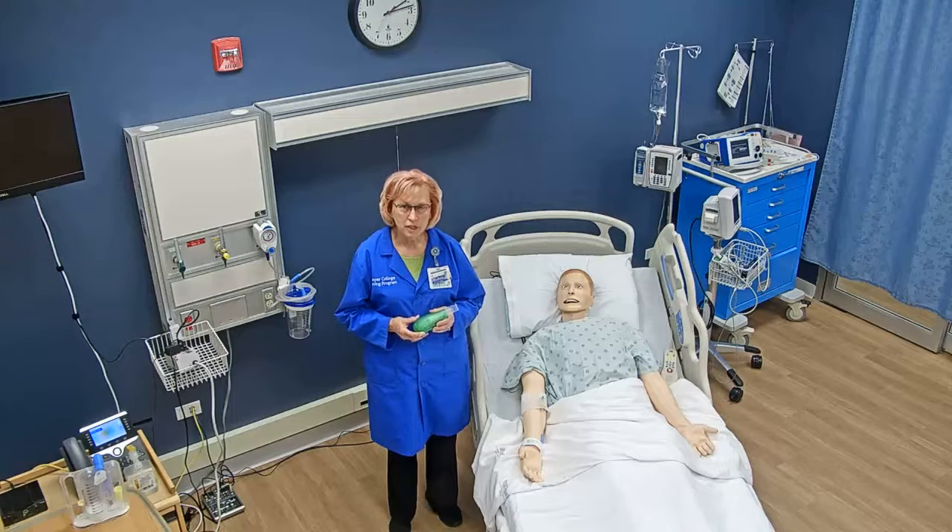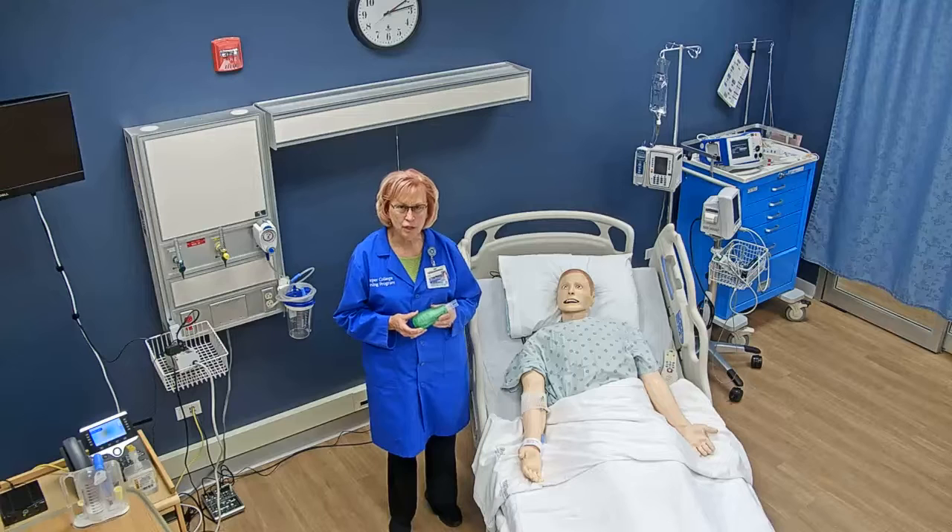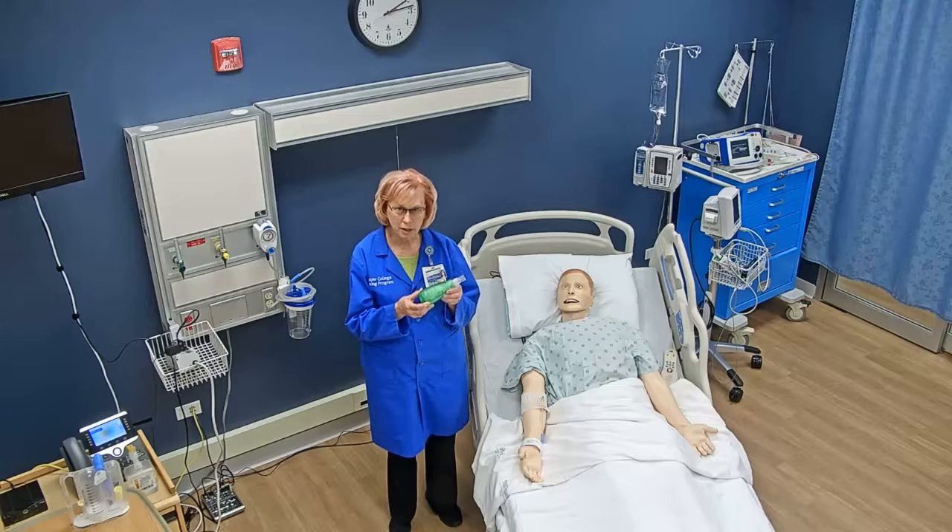Hello, this is how to teach your patient on how to use the Acapella vibratory PEP device.